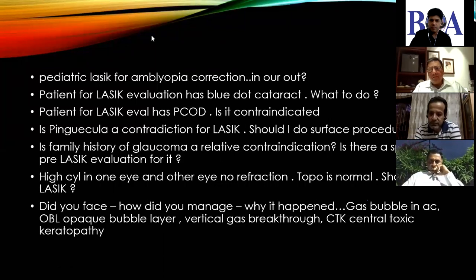Bhaja, would you like to take opaque bubble layer? Everybody has some opaque bubble layer. If it is excess, then I'd wait, and then go back and do it after some time.